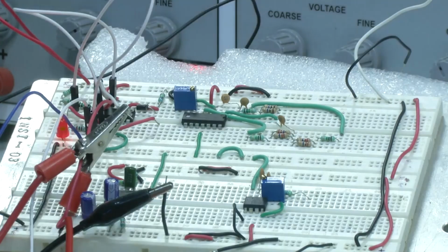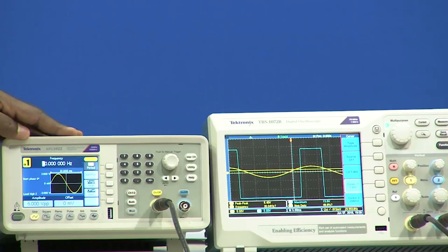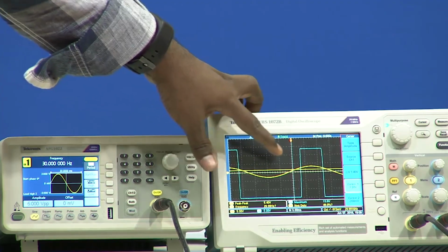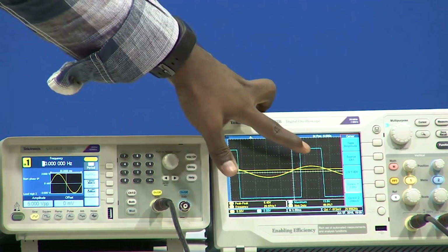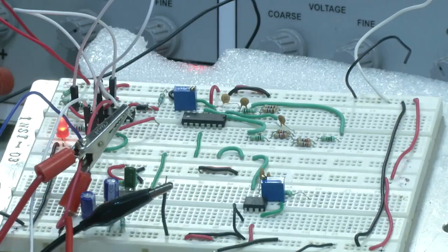When I do that, when you look into the oscilloscope, we can see we have kept it somewhere around 30 hertz, and in the oscilloscope we can see the high value. When you look into the breadboard, whenever it is higher, the LED starts glowing. Because of the smaller frequency, we can see the on and off of our LED too.